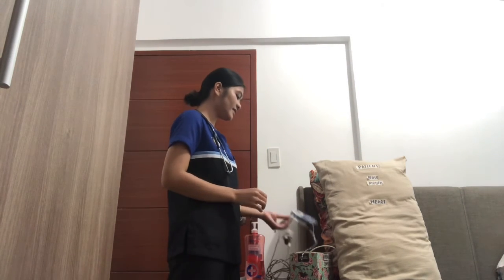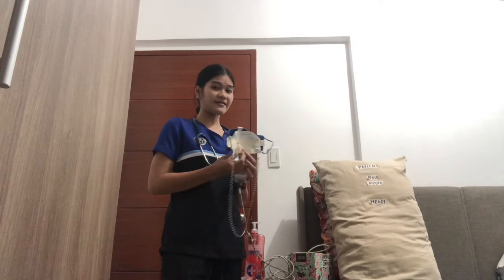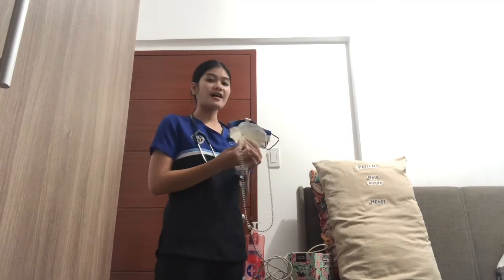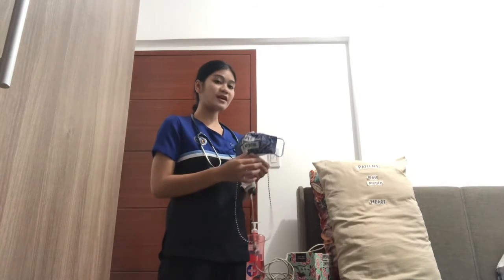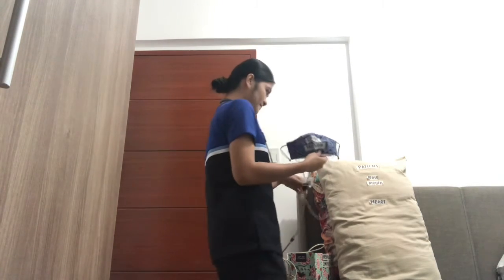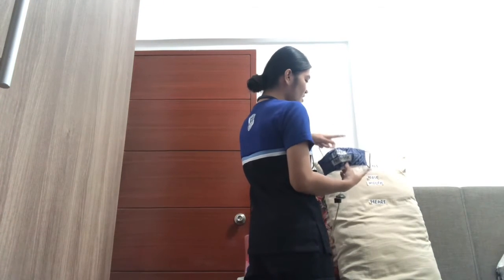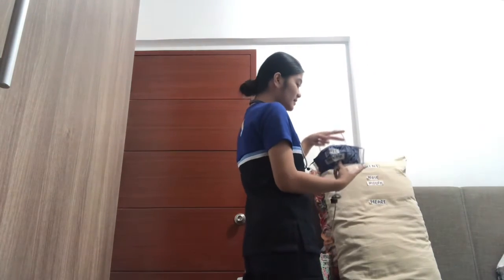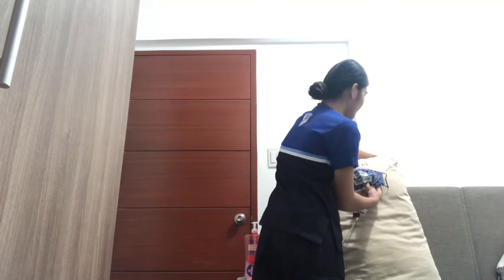After that, we will now turn on the compressor. Then, before putting the face mask to the patient, we should observe that the mist is present. Since we observe that the mist is present, we will now put the face mask to the patient. By putting the face mask, we should put it over the patient's nose and mouth and secure the elastic strap comfortably.